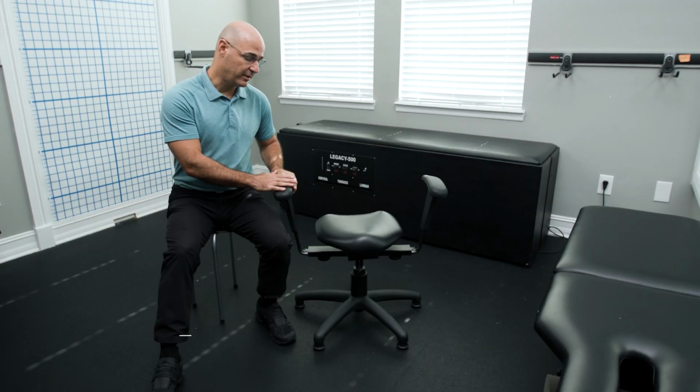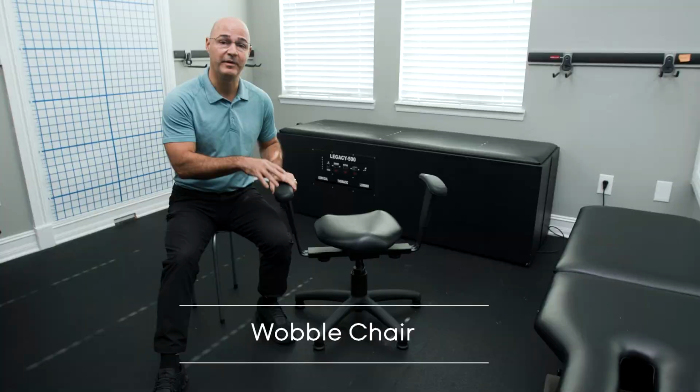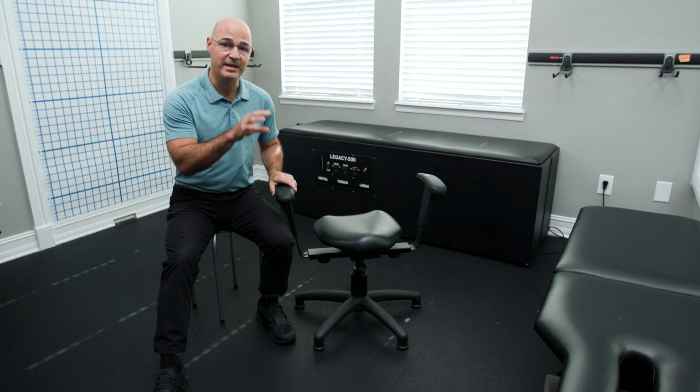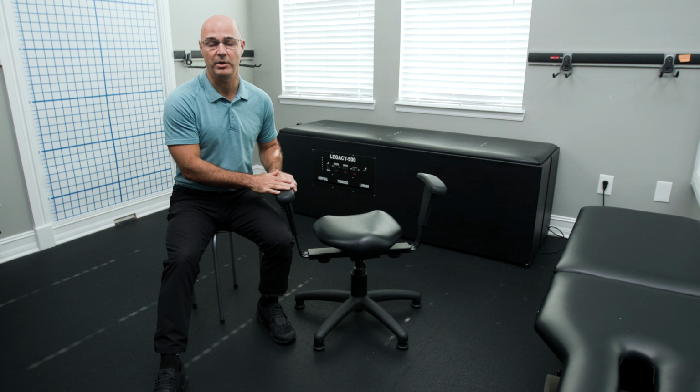This is the Wobble Chair. This Wobble Chair was developed by Dr. Burl Pettibon, and it was based upon the principle of increasing spinal flexibility. Now, why is this important for scoliosis? With scoliosis patients, we know that as the curve sets in, the spinal discs become rigid and become deformed into the shape of the scoliosis, developing a wedge-shaped disc, which will help promote and continue to develop the scoliosis.